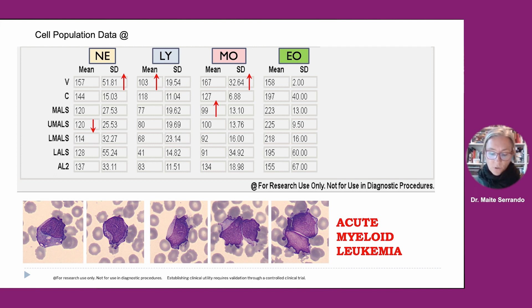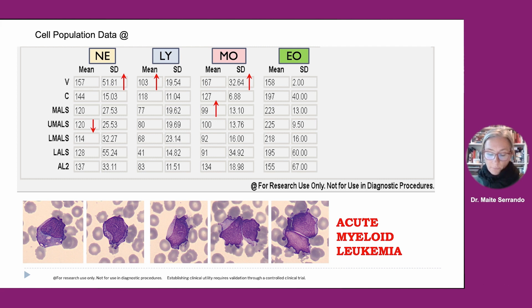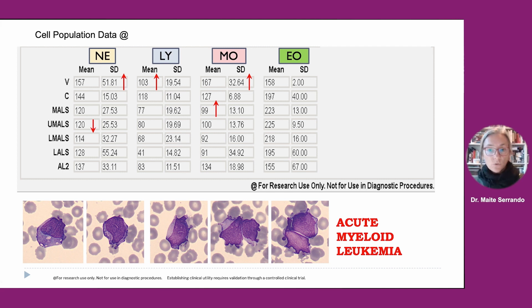Acute myeloid leukemia is the most important hematopoietic neoplasm to recognize because it can rapidly lead to death. No single morphological characteristic identifies cells as blasts. In general, blasts are cells that have a large nucleus, immature chromatin, a prominent nucleolus, scant cytoplasm, and few or no cytoplasmic granules. This condition must be identified as quickly as possible because it can lead to patient death within hours or a few days.